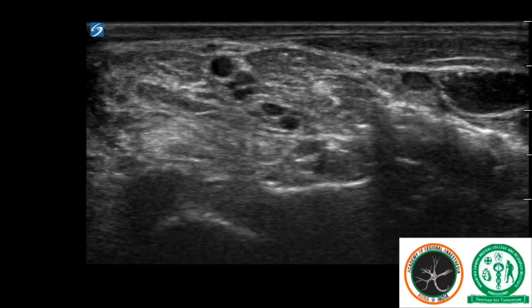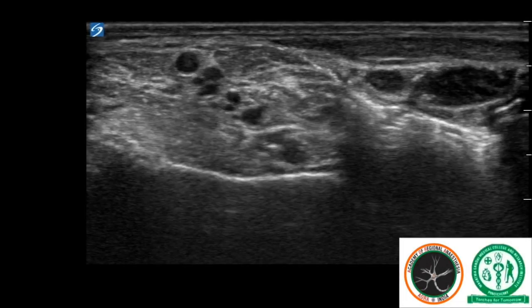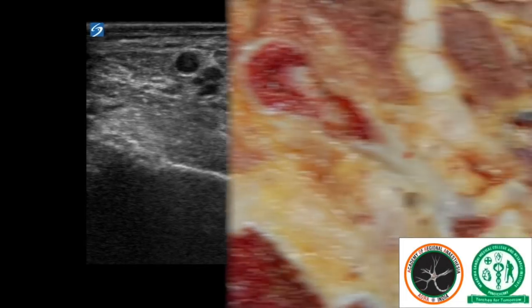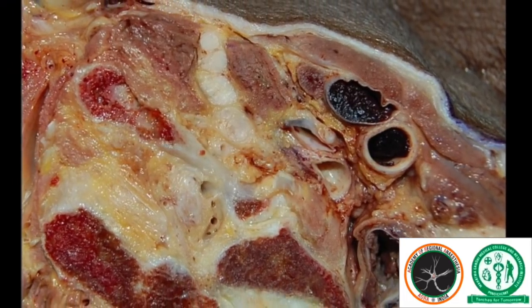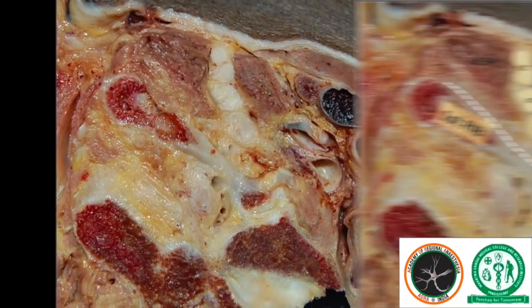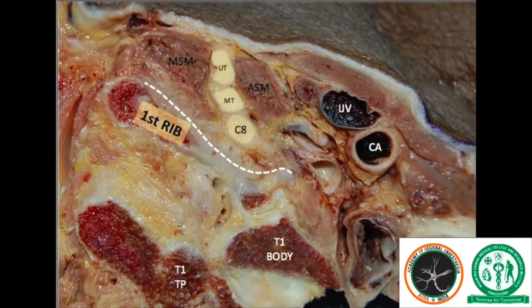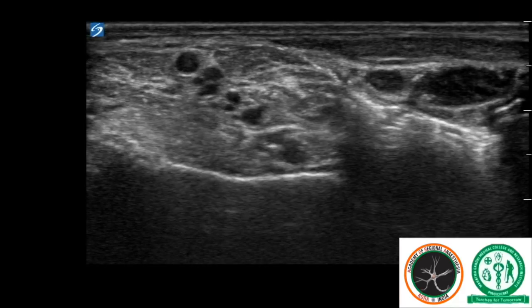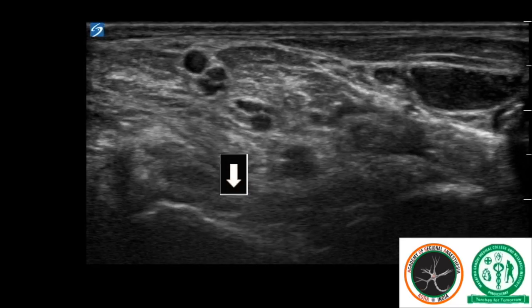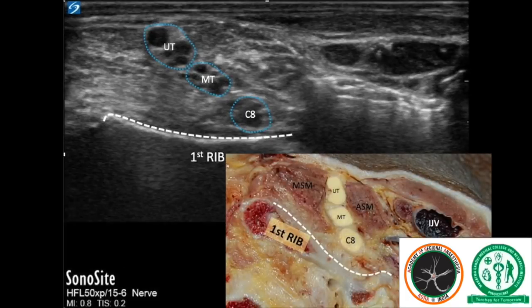At the C8 level, we assumed that the C8 root appears over the transverse process of the T1 vertebra. But actual anatomy revealed that the C8 root was on top of the first rib, and the transverse process of T1 was deep to it. In retrospect, we noticed that on the scanning image, just proximal to this point, the transverse process was visualized but the C8 root was not clearly identifiable. To conclude, when a clear C8 root is visible on the ultrasound, it is above the first rib.